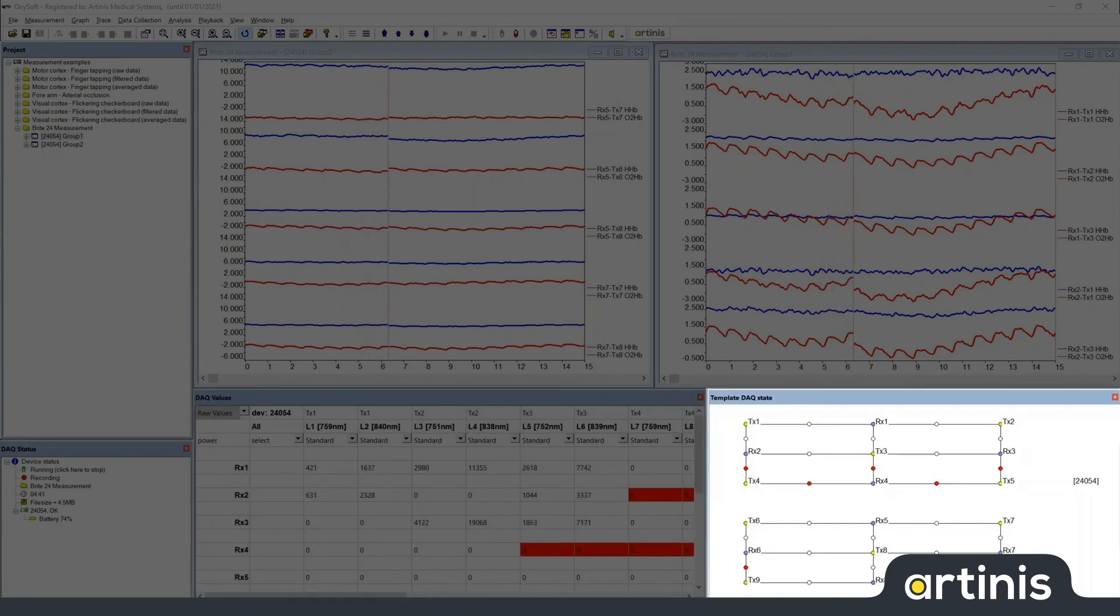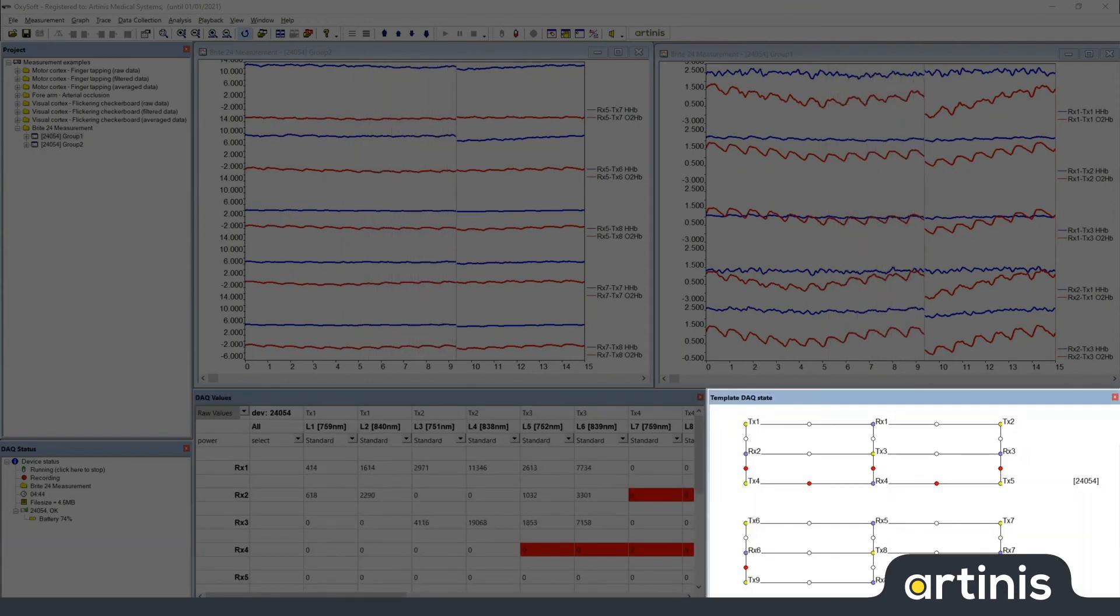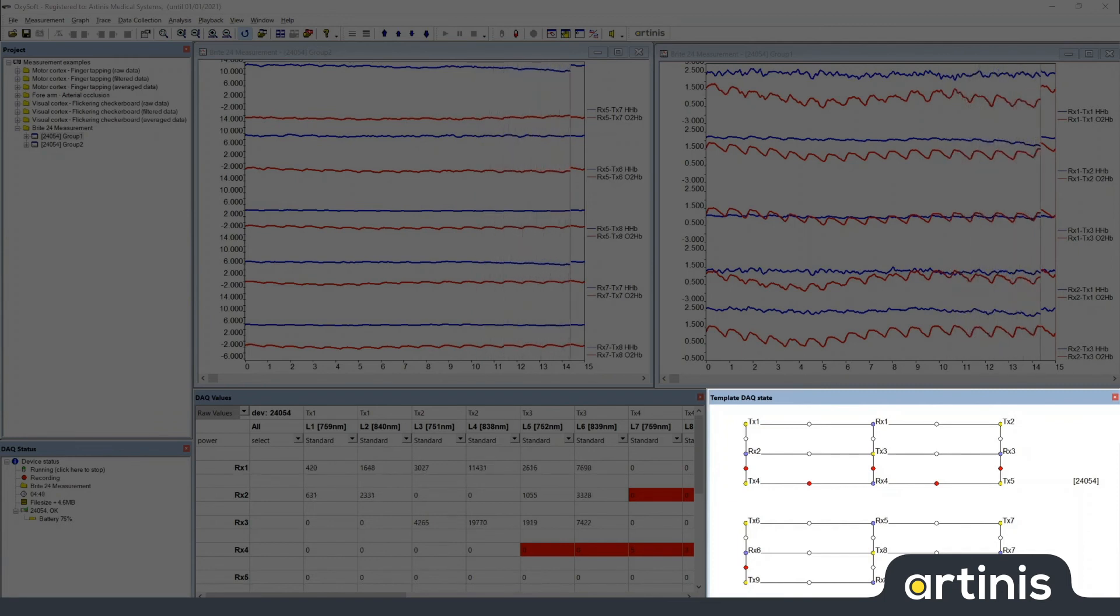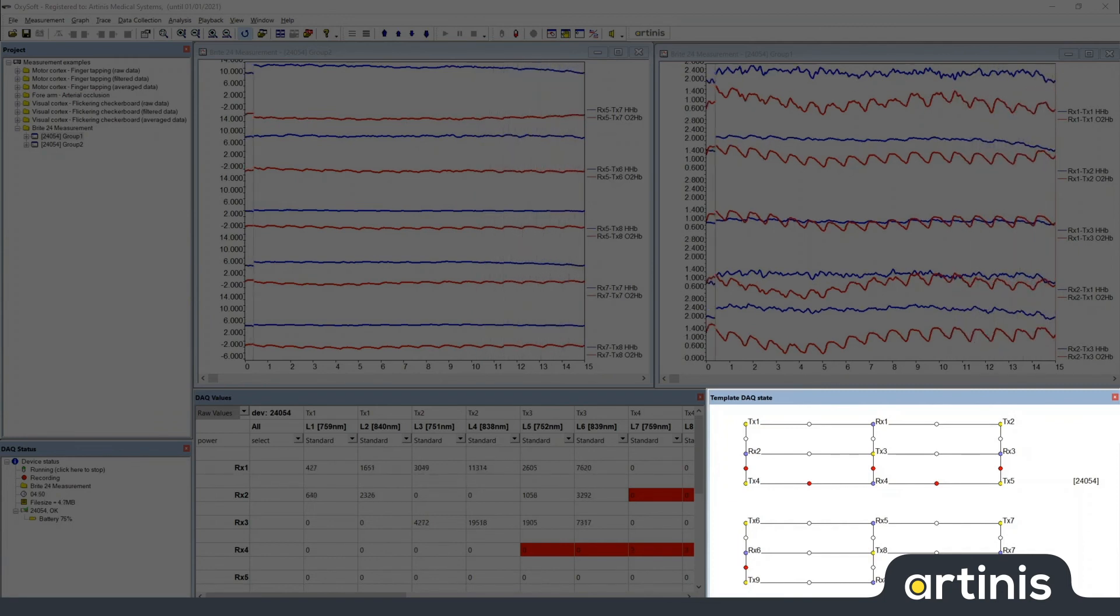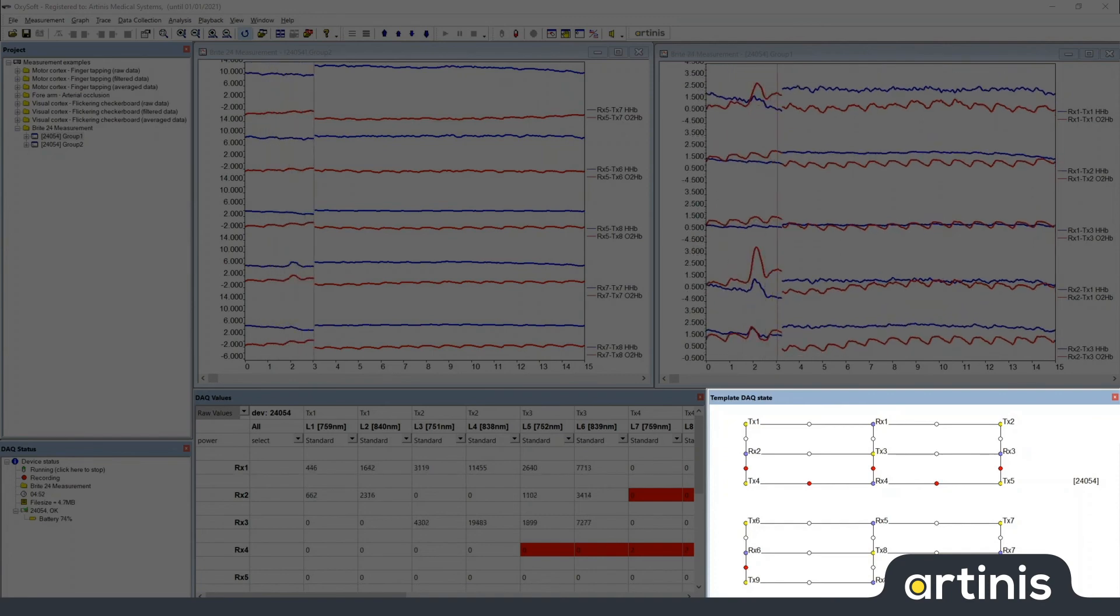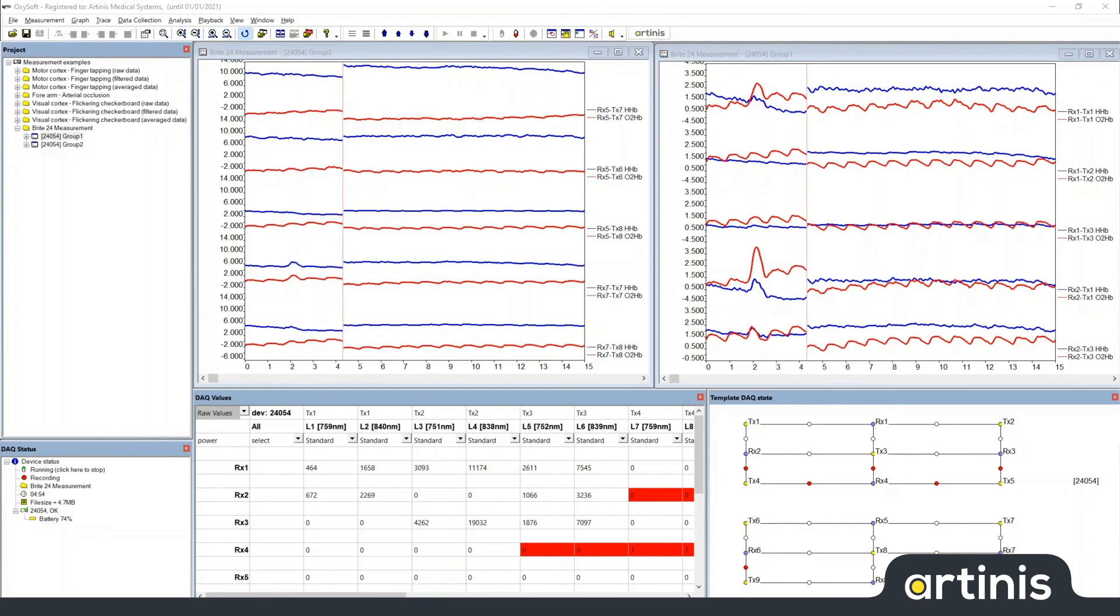To the right of that you have the template DAC state. This is a graphical representation of the information contained in the DAC values window. This simply makes it easier to locate the optodes where you need to fix them due to too much or too little light.